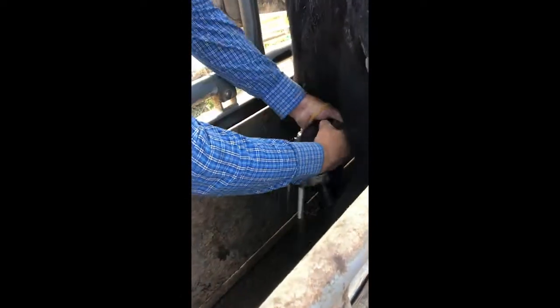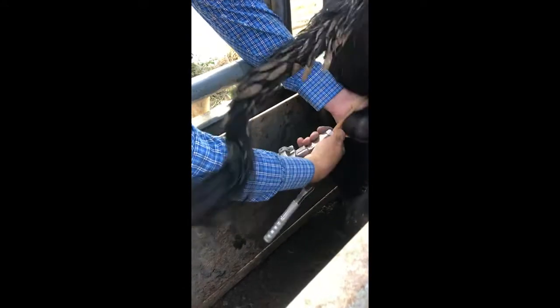This critter's moving around a little bit, but reach in and grab the nose of the bander and pull it around. Take the tip of the tail and bring it back snug — you still got two.